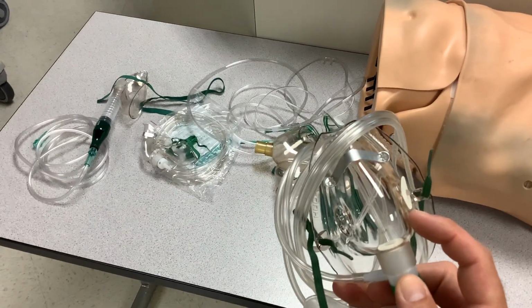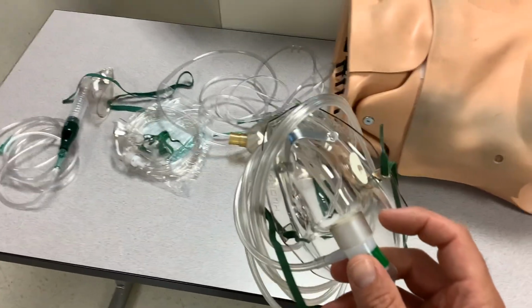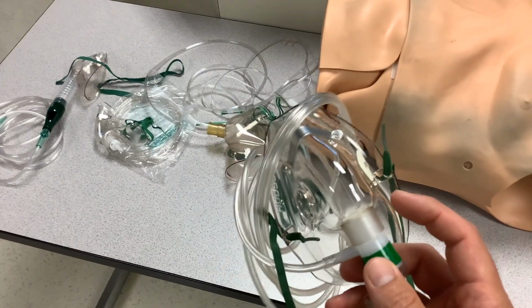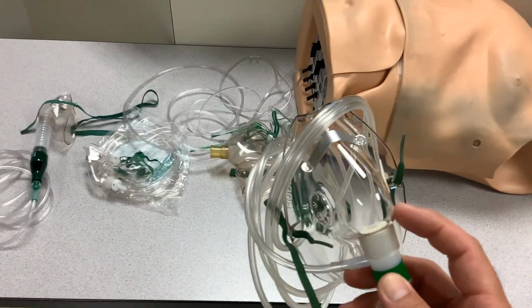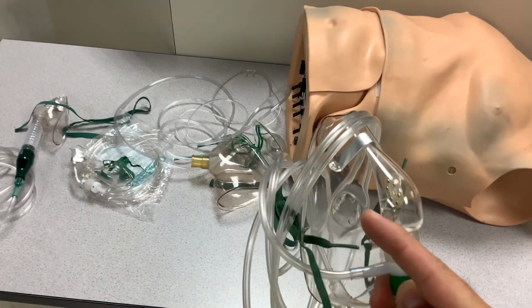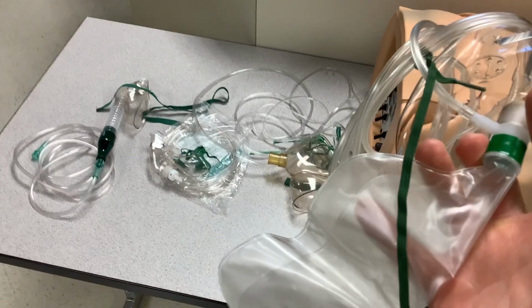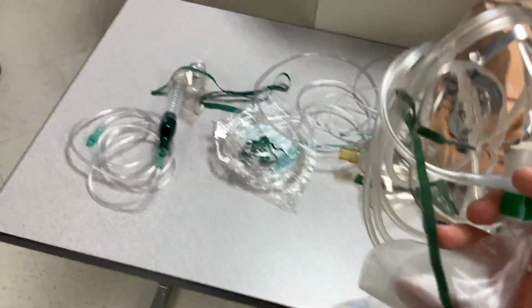And then when the patient exhales, this one-way valve opens. Now you can get close to 100% with a non-rebreather, but it's probably not going to be quite 100% because as the patient's breathing in, they will also breathe in room air through those dots. However, the majority of what they should be breathing in should come from that reservoir bag, which is 100%.